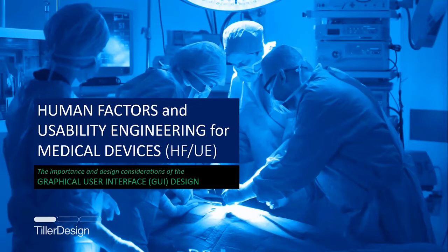And that vial was injected into the person and they died. It would have taken a very disciplined, trained eye to actually tell the difference. And when you've got someone operating under extreme duress and in a noisy, crowded environment, which medical environments often are, it's not surprising. The only surprise is really that we don't have more of these problems.